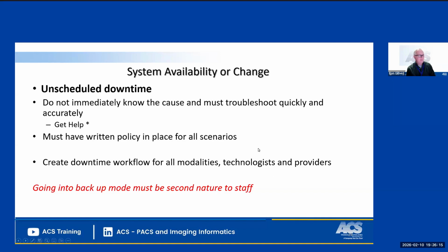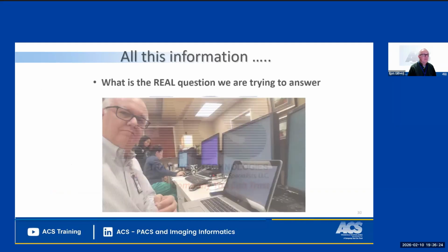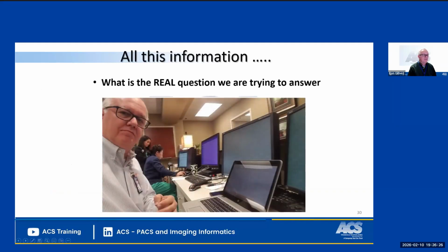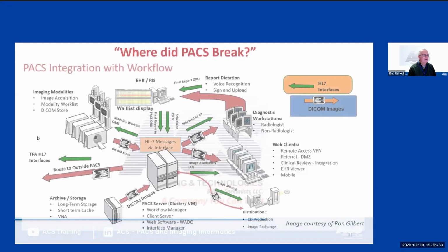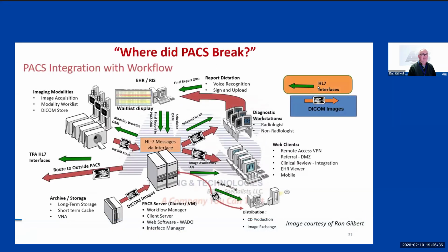And that's when you want to look at backup systems. So going into backup must be second nature to the staff, and we get to write those procedures. So we designed that. But the real question you're trying to answer, and this is me troubleshooting a cardiology workstation, is where did it break? So yes, I showed you these diagrams, and it's very important to understand, is it an HL7 interface? Is it a DICOM interface? This one picture right here is your roadmap to figuring out how to support a PACS system, and you'll get more detail in the course.